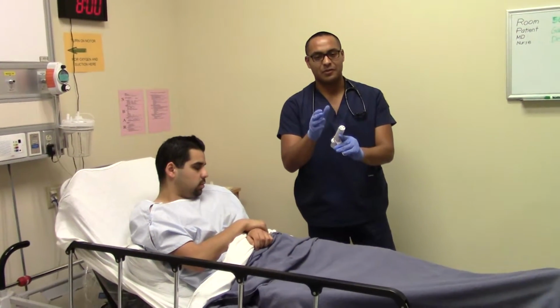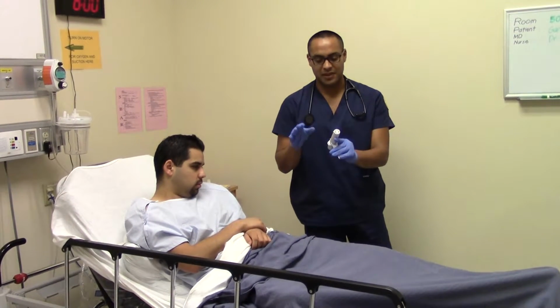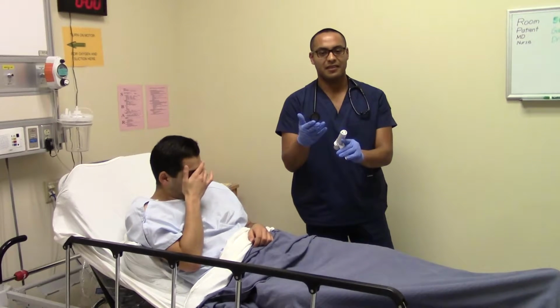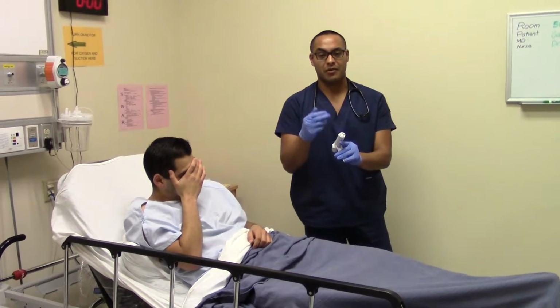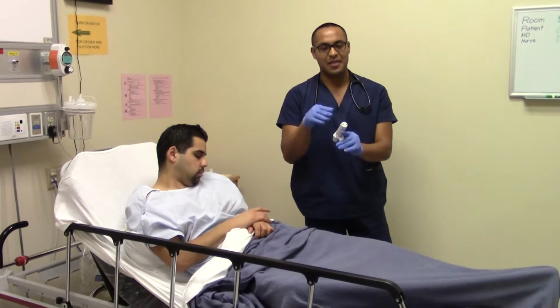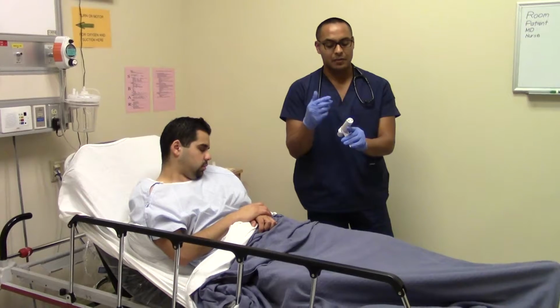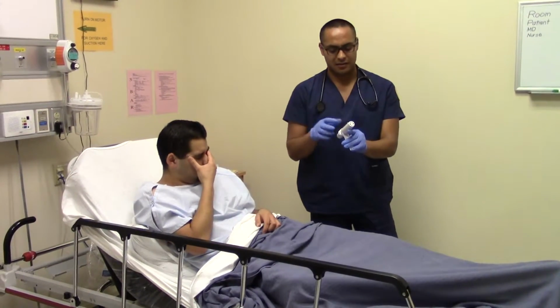He's not breathing that good. The patient didn't breathe that good. In real time, I want a better effort, but this is just a competency video. I know that would not be enough for me to put that number down. I want the patient to do it again. That's the second time doing it, I'm going to do it again.